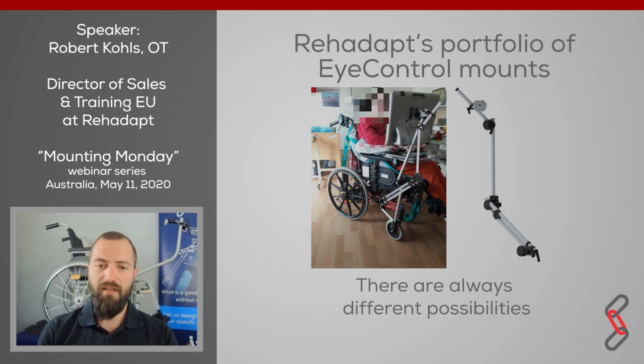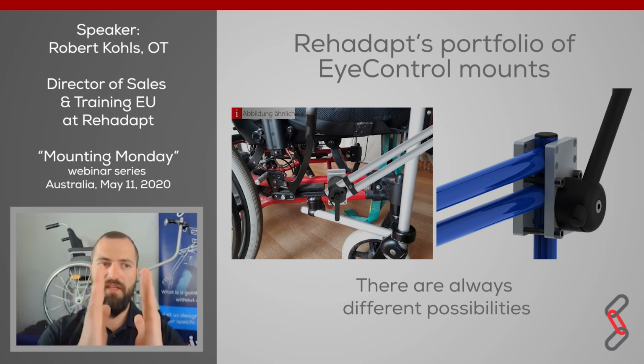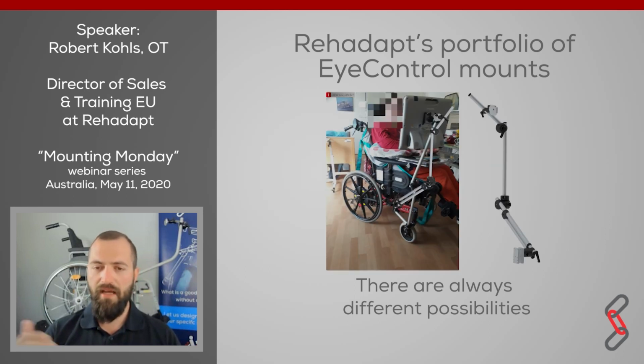So now we have a better angle at the beginning of the wheelchair, so it could be better adjusted. Option number 2 could be that we use the 2 mounting plates of the RKLE 3070 and put them together from both sides of the wheelchair, but with the same end result. So it looks completely like the same solution as with the semi-open frame clamp, also with the double tube. But with this solution, you would not get in trouble when you need to drive through doors.